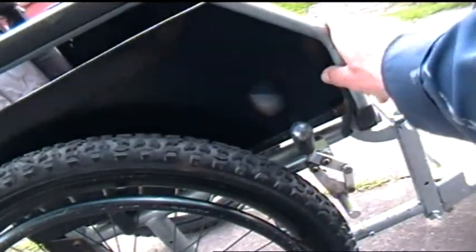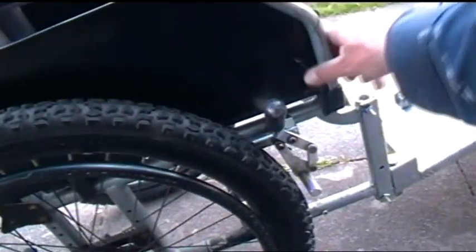So by doing what I've done, it's given better protection. You can still get your hand in under the handrail here, and you can still operate these sides so that you can get in and out with the side raised. Both sides raise up if you want them to. Yeah, so that's pretty much it.